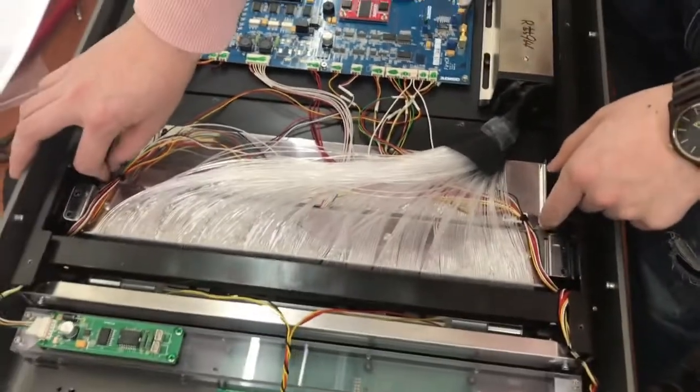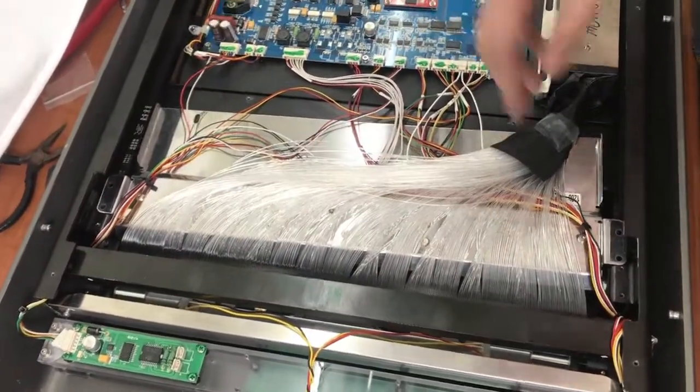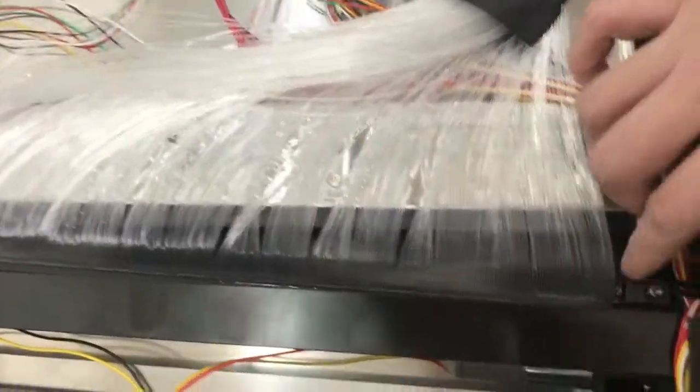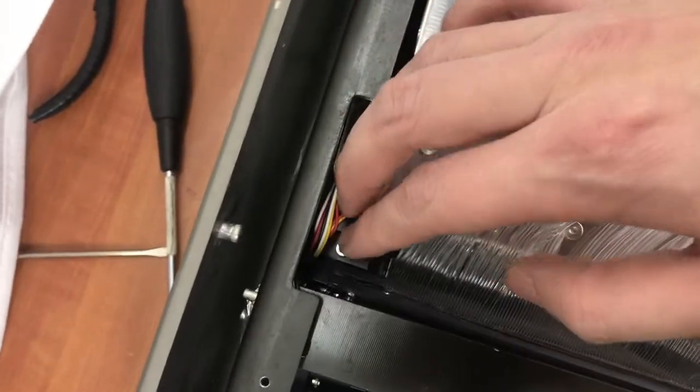I already disassembled these two screws. After that, just push it a little bit to the back side. Later on, you can see there are one and two screws in here as well. Please try to disassemble those.